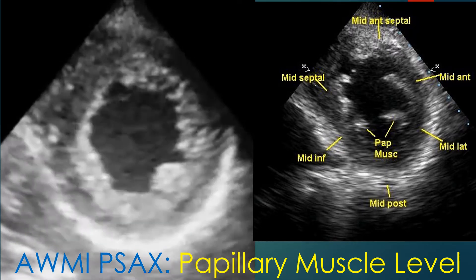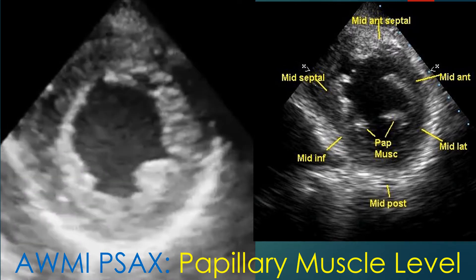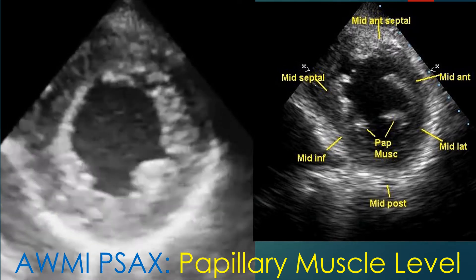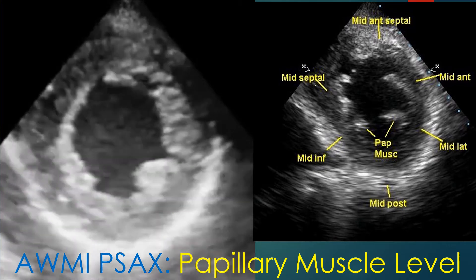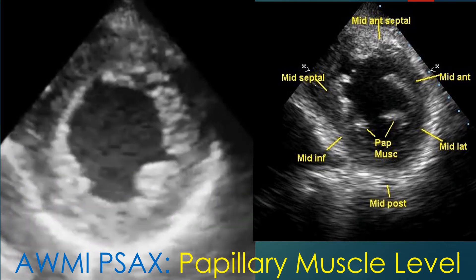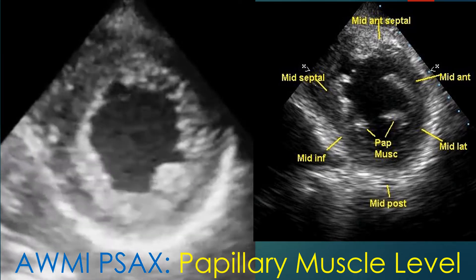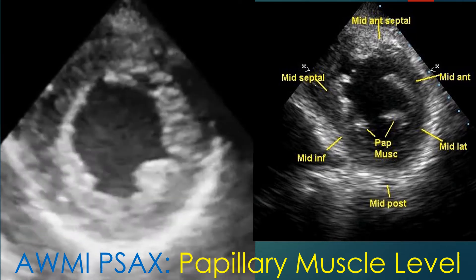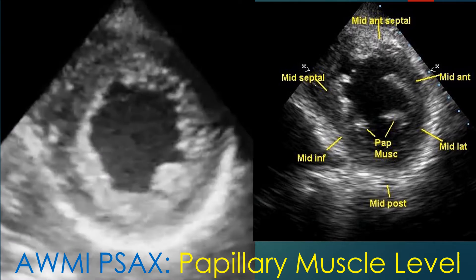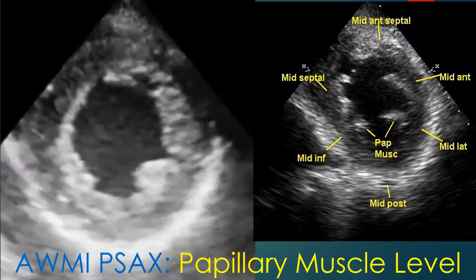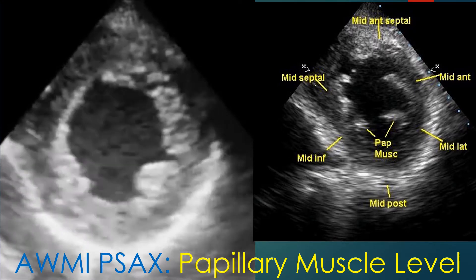Parasternal short axis view at the papillary muscle level showing mid-anteroseptal hypokinesia. Other segments at this level are mid-septal, mid-anterior, mid-lateral, mid-posterior, and mid-inferior.